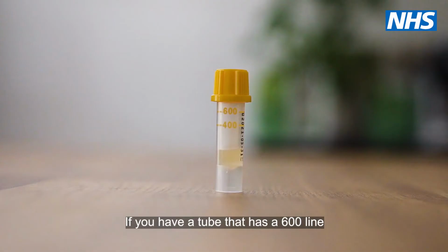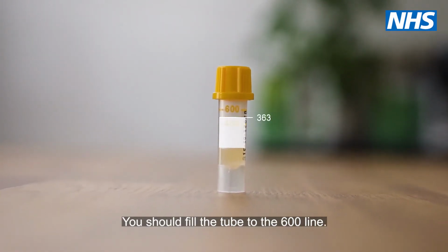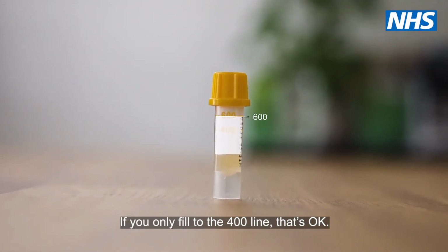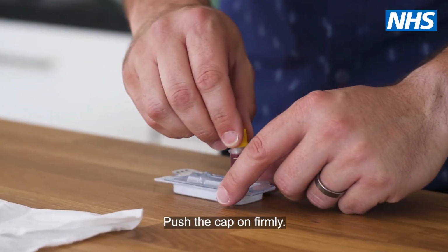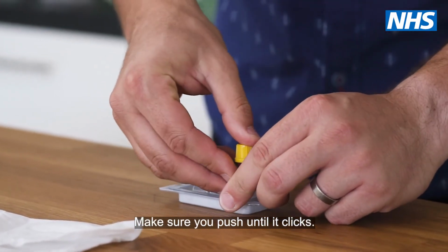If you have a tube that has a 600 line, you should fill the tube to the 600 line. If you only fill to the 400 line, that's okay. When you have got enough blood, immediately place the cap onto the tube. Push the cap on firmly. Make sure that you push it until it clicks.